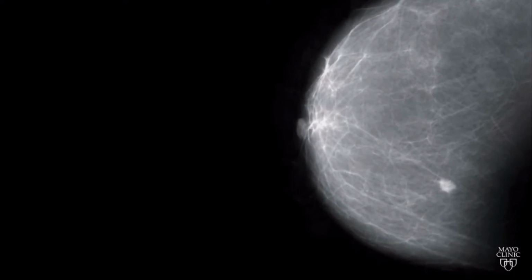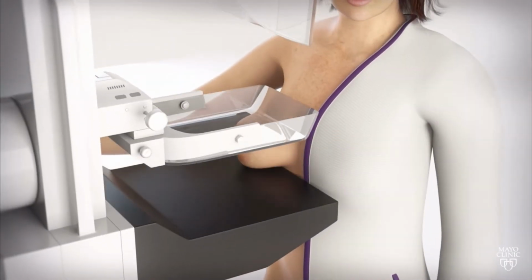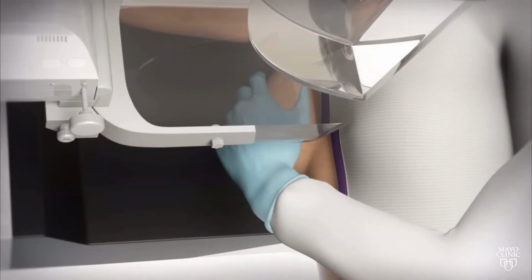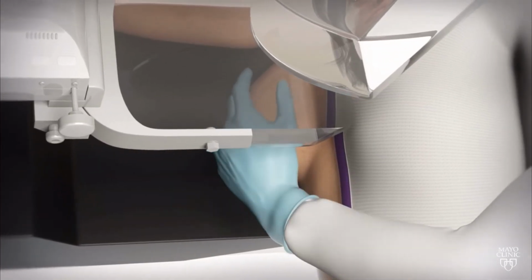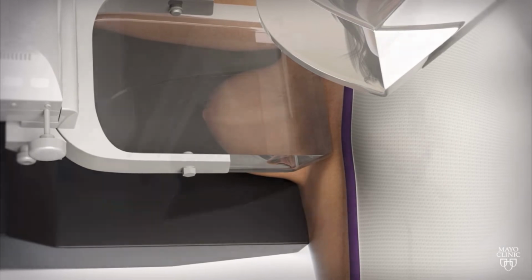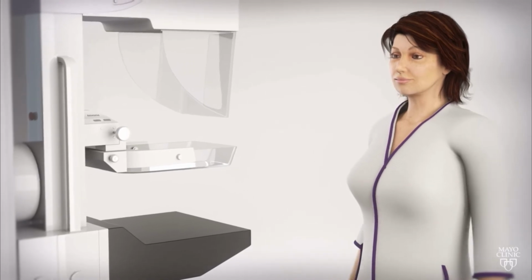The X-ray image is either created on a film cassette located below your breast or recorded digitally and stored in a computer. Denser breast tissue, such as cancer or calcifications, appears bright and white, whereas less dense tissue, such as fat, appears dark or gray. After the X-ray is complete, the compression will release and the technologist will change the angle of the machine. Again, position your breast on the flat surface, gently lower the compression paddle, and take one more X-ray. Following the procedure, the images are processed and made available for review and interpretation by your doctor.